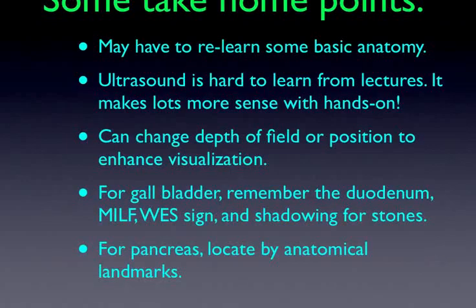So let's conclude with some take-home points. We may have to relearn some basic anatomy, especially when it comes to locating the pancreas. The ultrasound is, I think, somewhat hard to learn from lectures. I enjoy giving the lectures, but it's so much easier once you get a few good views with the hands-on session. So I want to leave a lot of time for everybody to have practice with the hands-on sessions.